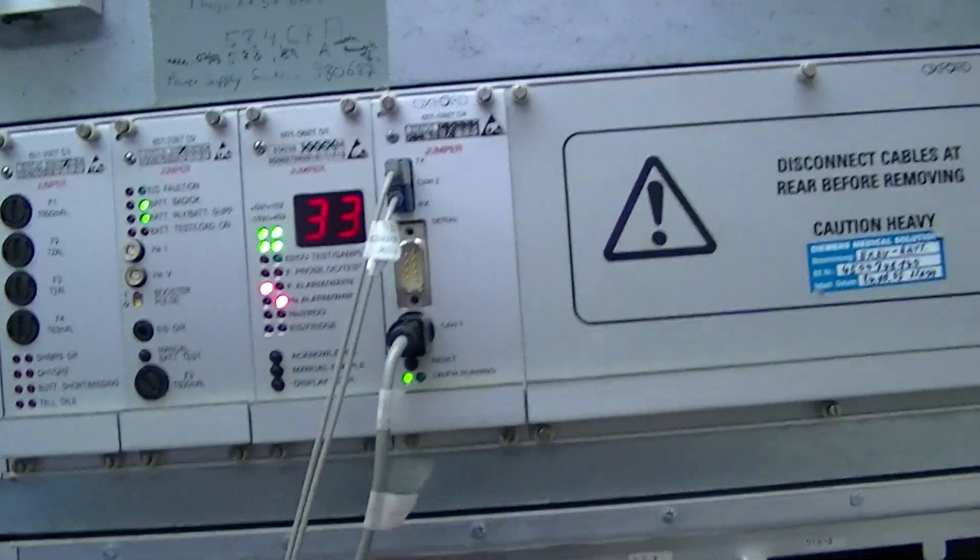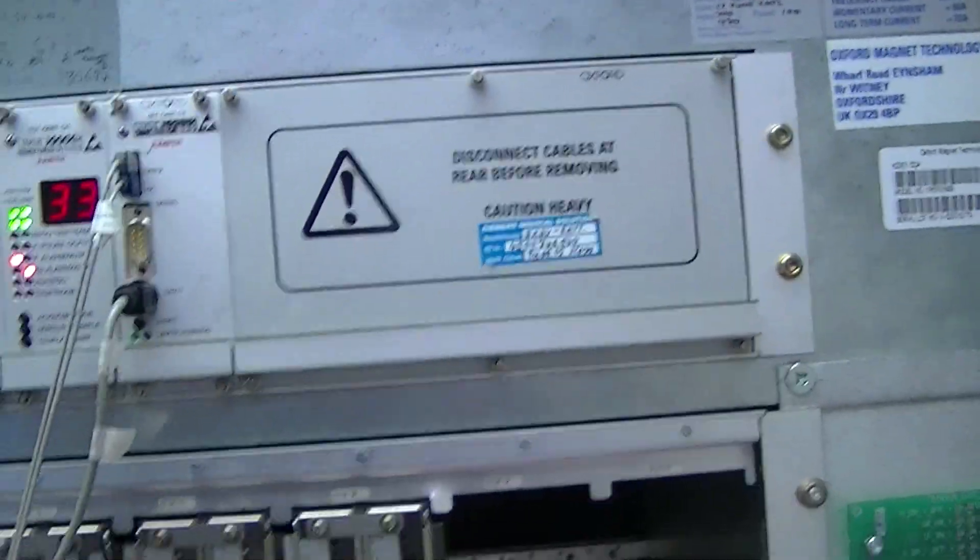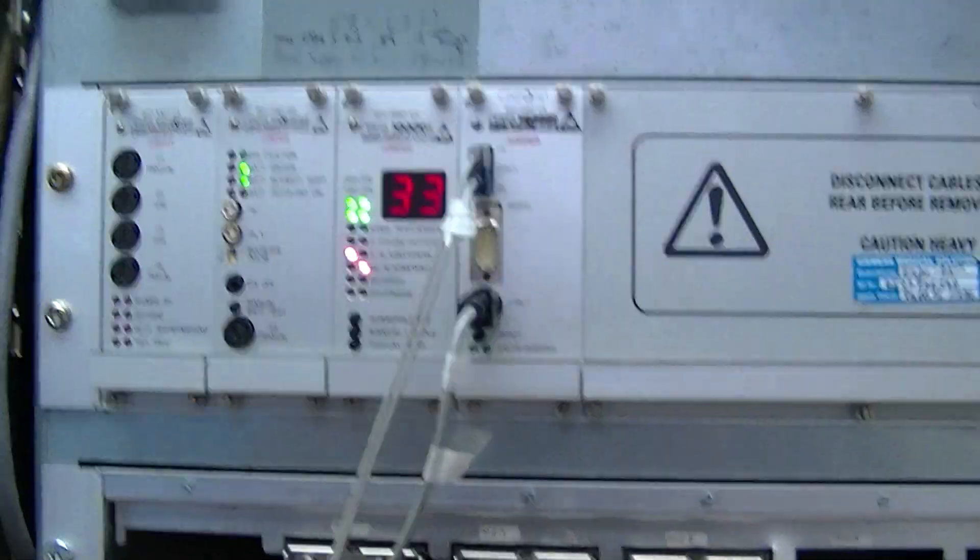In this video we're going to be going over the CCA cabinet on a four-channel Symphony. This magnet is currently not at field, in a trailer, and it's getting refurbished.